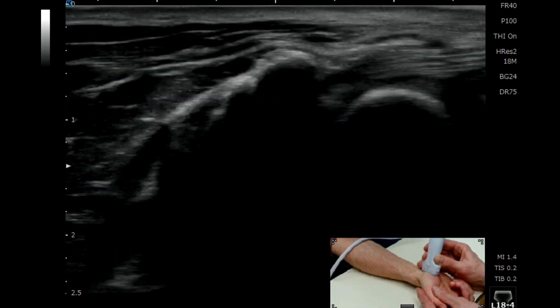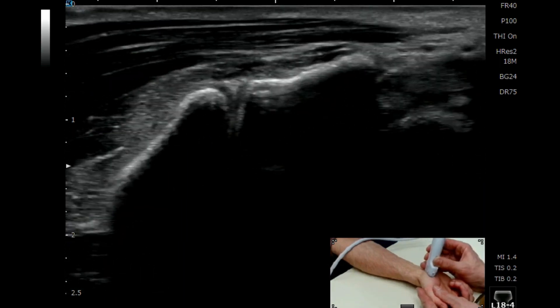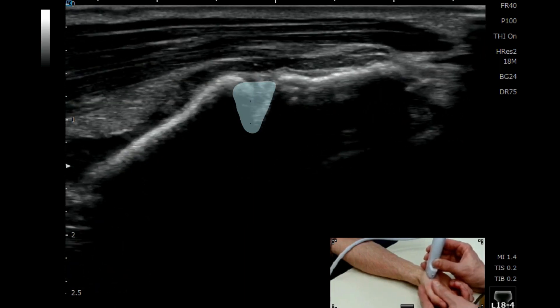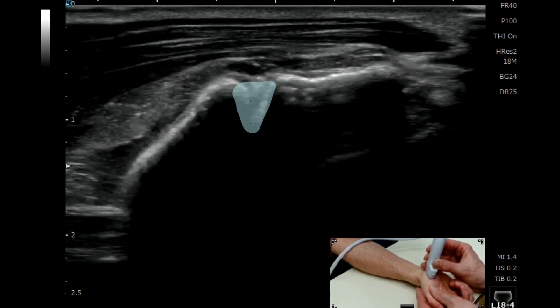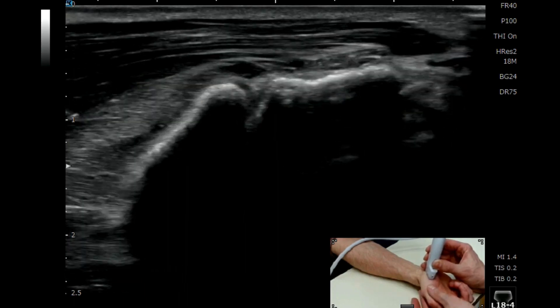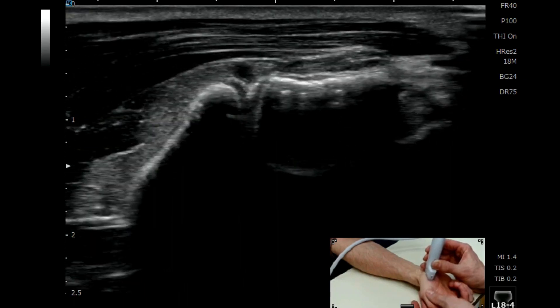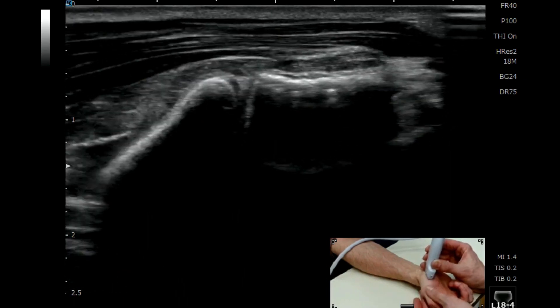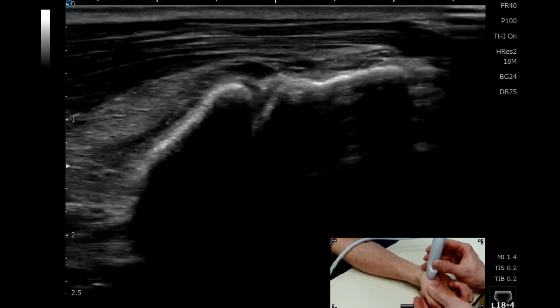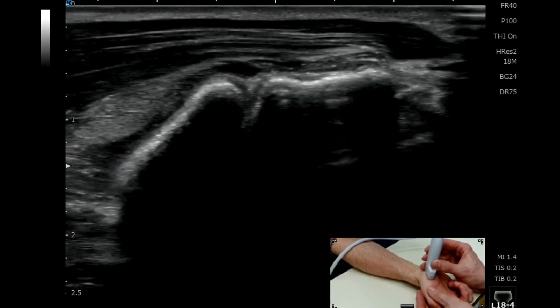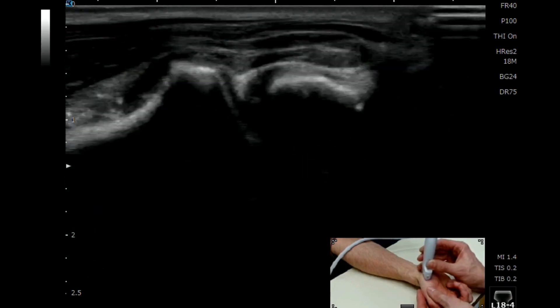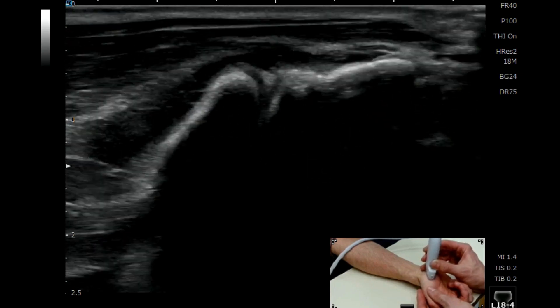If you then just divert your probe a little bit more down the line of the thumb, you get a really nice view of the palmar aspect of the first CMC joint. This is where you most notably see the pathological change — osteophyte spurring around the joint margins, certainly osteoarthritic change, and synovitis.